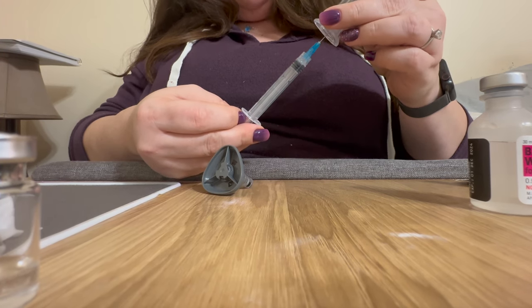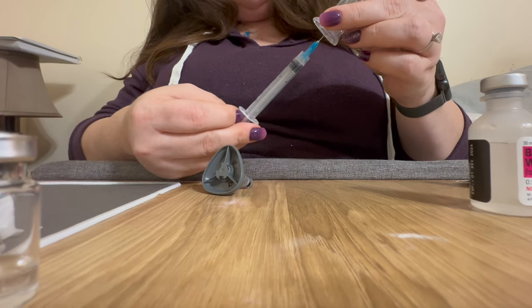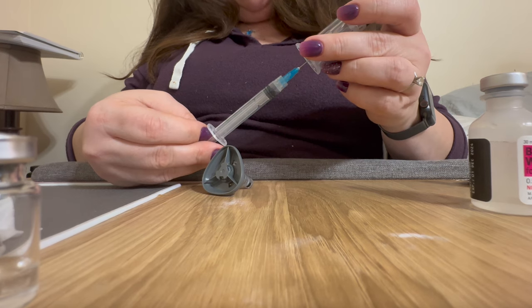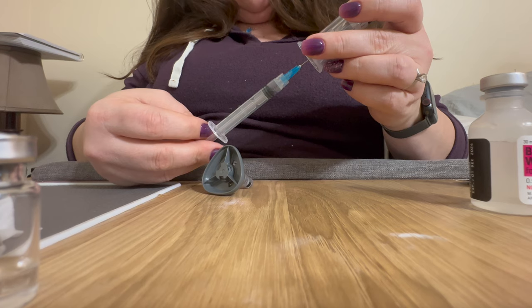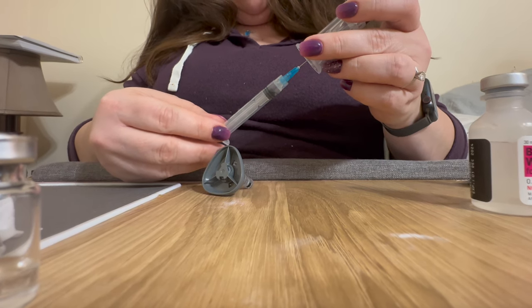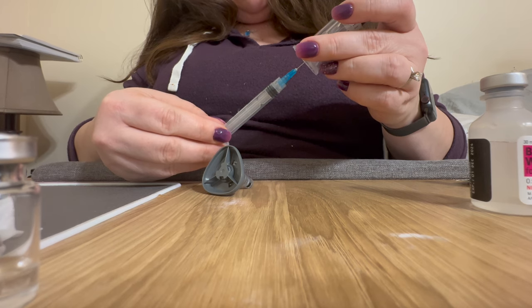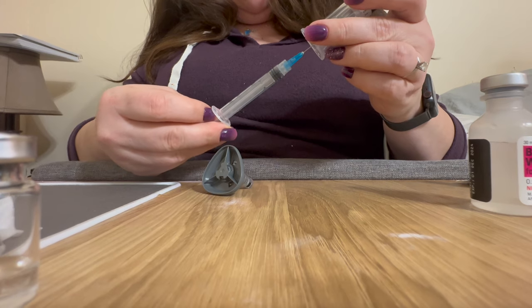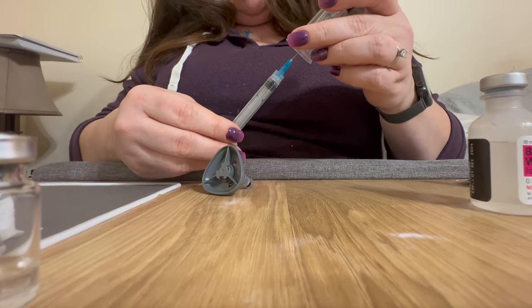Slowly, slowly pull back the plunger and you'll start to see little bubbles go into the vial of Mounjaro. What you're going to have to do is go back and forth a little bit — I'm drawing it out but there's some air coming in as well as the Mounjaro, so I press it back again until the air is out, and then I keep slowly withdrawing it.